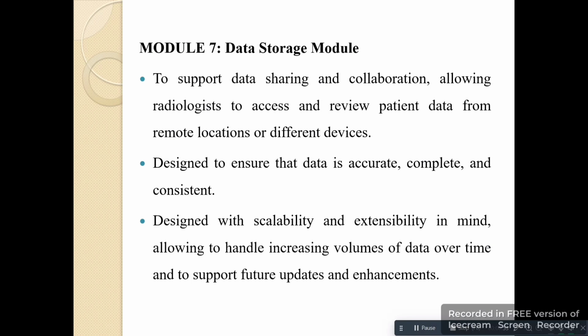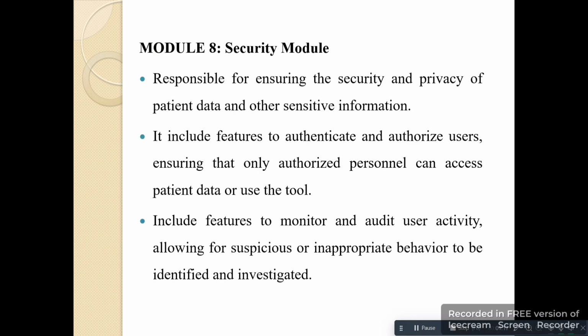Module 7, Data Storage Module, to support data sharing and collaboration, allowing radiologists to access and review patient data from remote locations or different devices. Designed to ensure that data is accurate, complete, and consistent. Designed with scalability and extensibility in mind, allowing it to handle increasing volumes of data over time and to support future updates and enhancements. Module 8, Security Module, responsible for ensuring the security and privacy of patient data and other sensitive information.